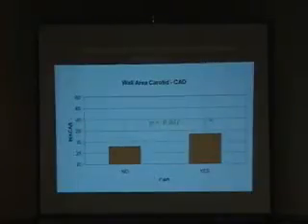But if you now look specifically at the disease itself, and this is the power of this measurement, for example, looking at the wall area in these carotid patient, in this coronary disease patient. Now, obviously, the group with coronary artery disease is going to have more plaque. And the same thing has happened also in the aorta, that the patient with CAD have not only plaque in the carotid, but also have plaque in the aorta. And now we can differentiate between these two subgroups.